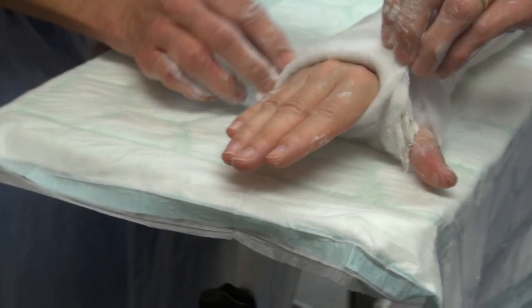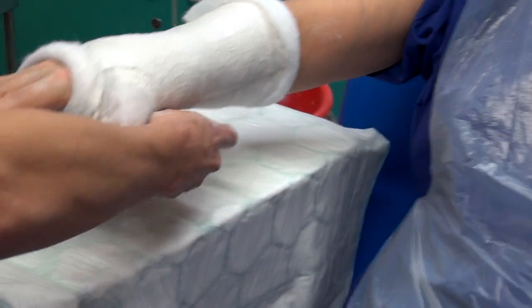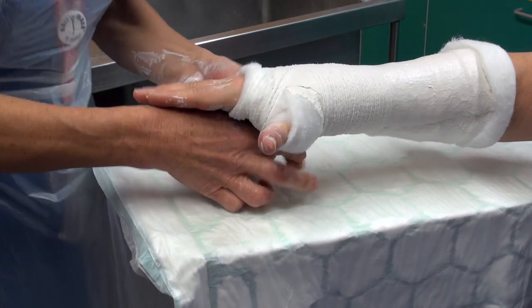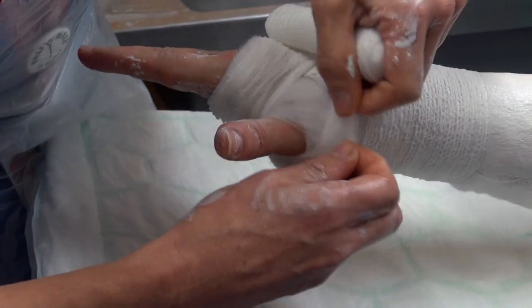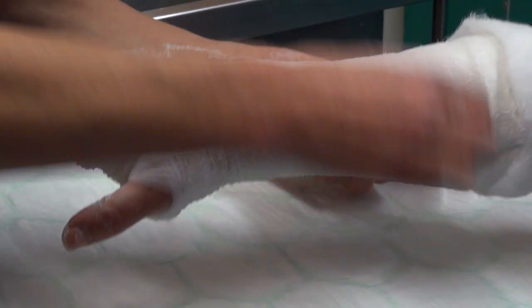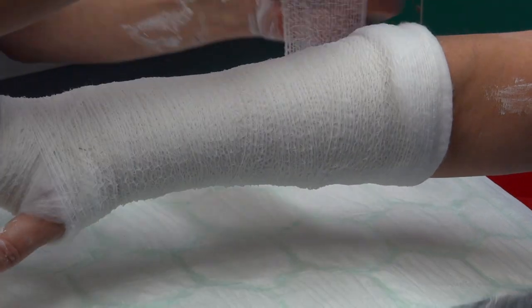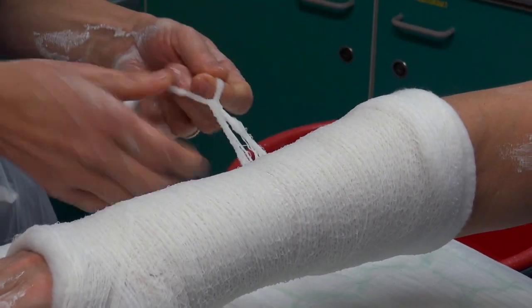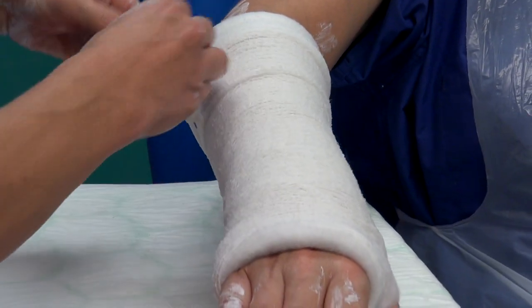So I'm now going to turn back my ends and start bandaging around the wrist just to anchor it on. Coming through near the thumb there, giving it a little squeeze together, back around again, catching all the ends of the padding and making sure we've got no rough edges around the thumb. Then heading down the arm back to those edges at the top — a nice smooth edge — and then I'm going to tie that off. We just need to make sure that knot is away from the fracture site.